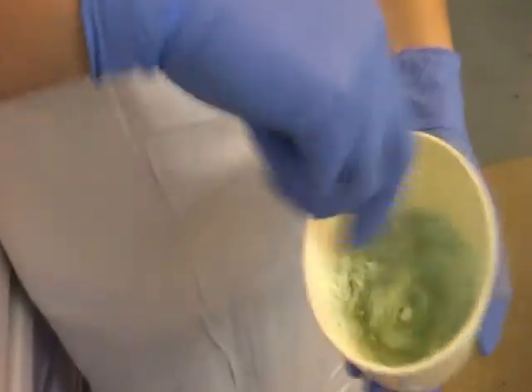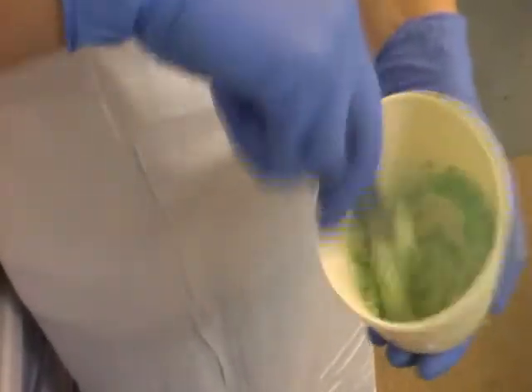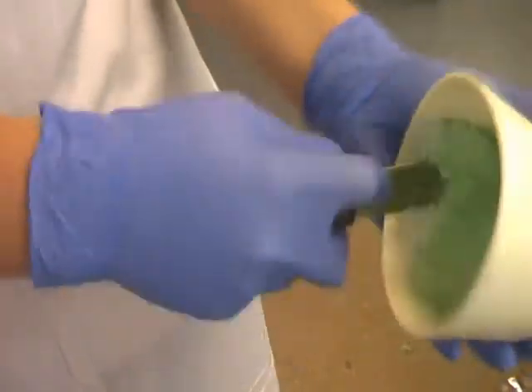When ready, pour the water into the mixing bowl containing the alginate powder and mix thoroughly. You need to work rapidly due to the limited working time. The aim is to have a smooth mixture as demonstrated.